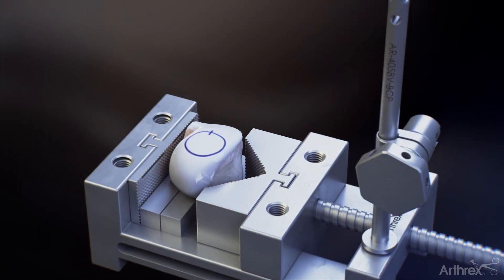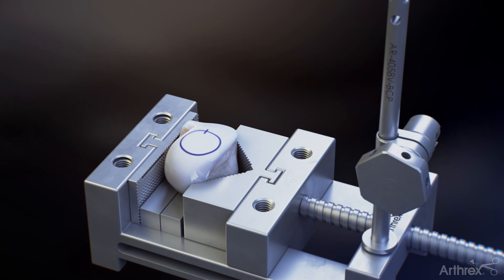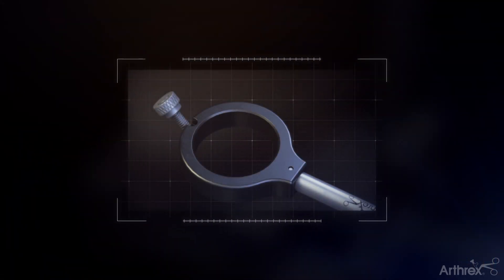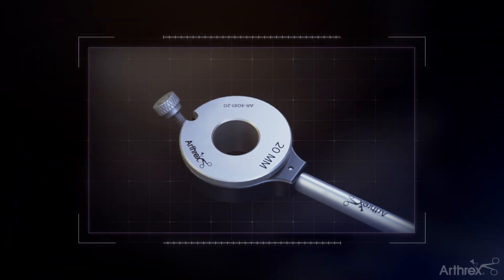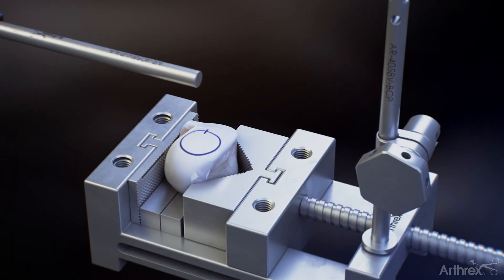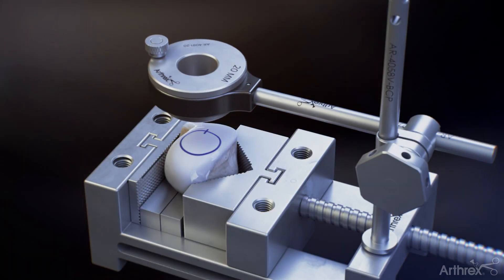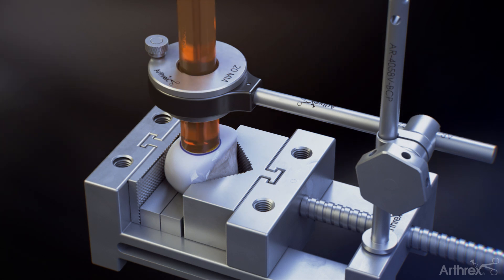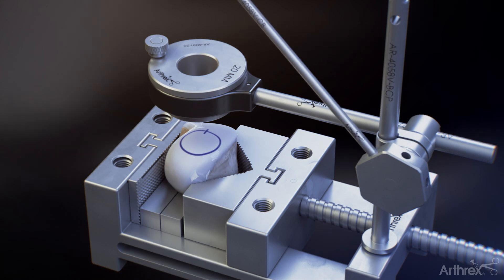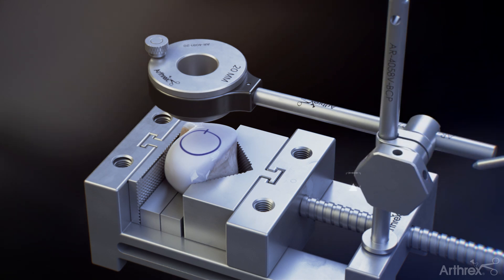Secure the donor allograft in the allograft OATS workstation. Place the appropriately sized allograft OATS workstation and bushing into the articulating arm housing. Move the articulating arm over the graft and set the exact angle necessary to match the recipient's contour. Use the OATS sizer to confirm you are perpendicular to the graft. Securely fasten the housing using the hexagon bolt and cheater bar.